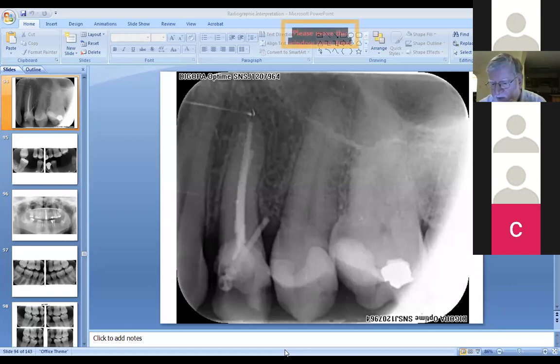Remove the decay and see, have you been able to take a follow-up x-ray? Have you done a decent job? Have you been able to eliminate all the decay? Is the tooth nicely sealed? Then, was there a pulpal exposure? Is it going to need endodontic treatment?